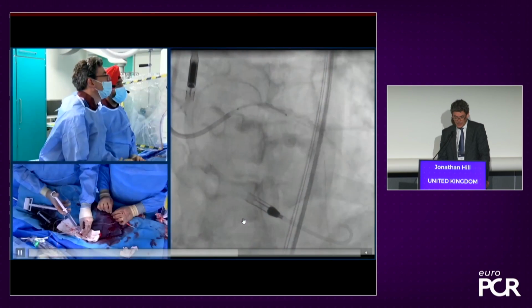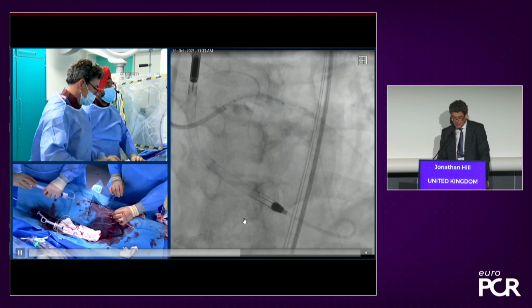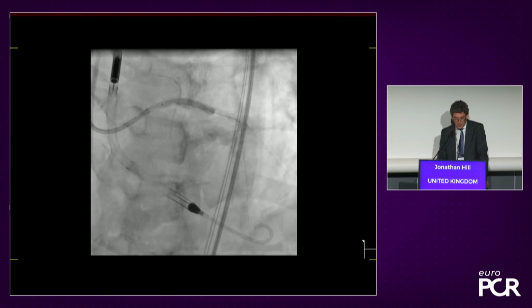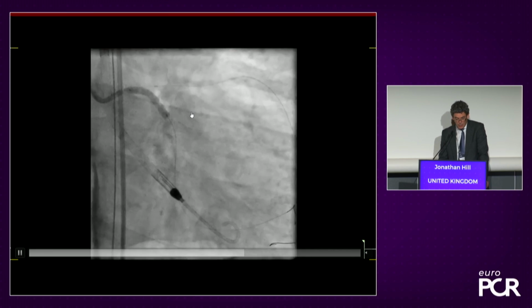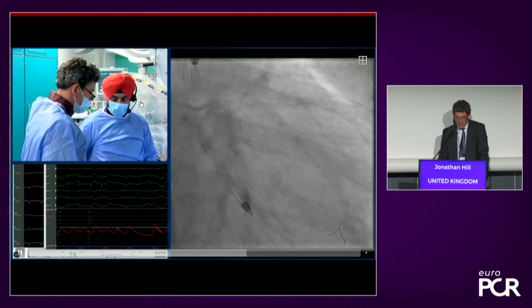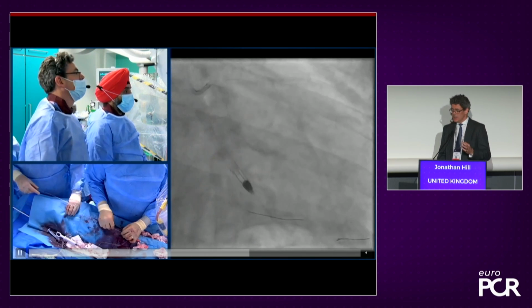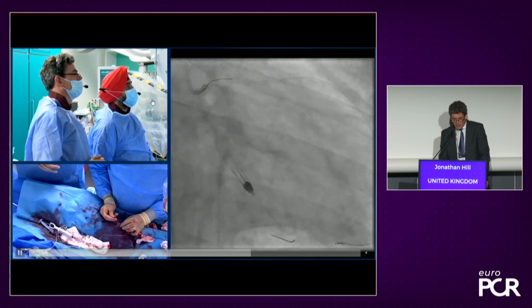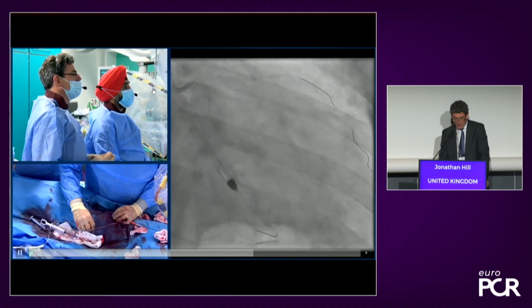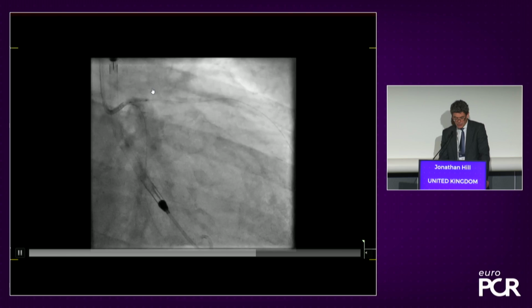full expansion. In this case, we used a bifurcation stenting strategy with culotte, so a 2-stent strategy. We won't go into why we chose that, but that's probably what we have most comfort with. But here you can see with that initial stent implantation that there was really excellent expansion at the region of the tightest constriction. And then workflow is pretty rapid, wire exchange there, and we then deal with the left main bifurcation. Opening up the struts.